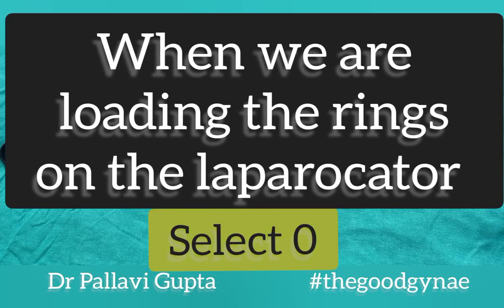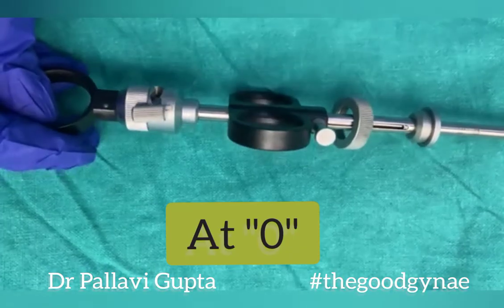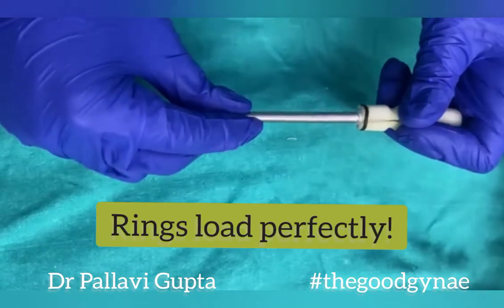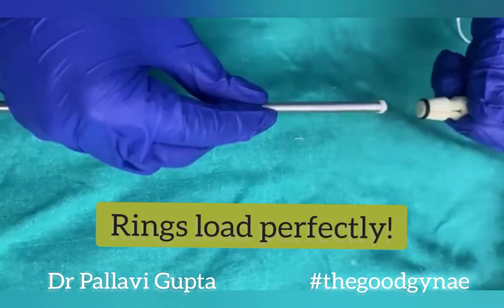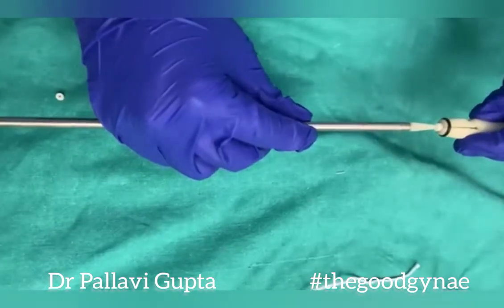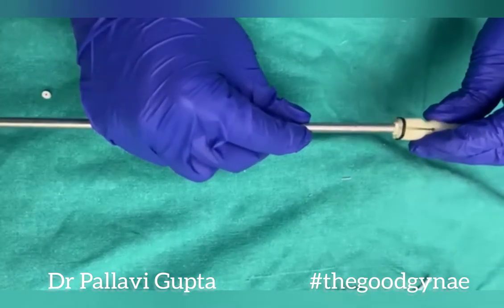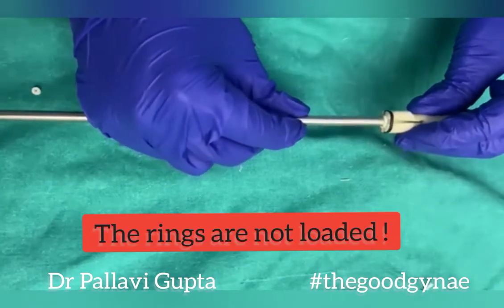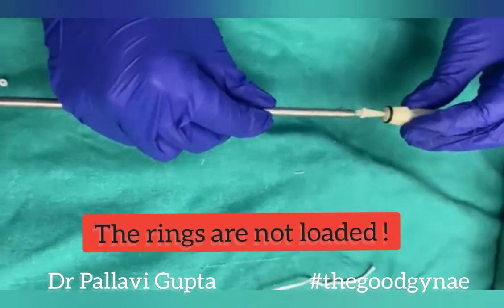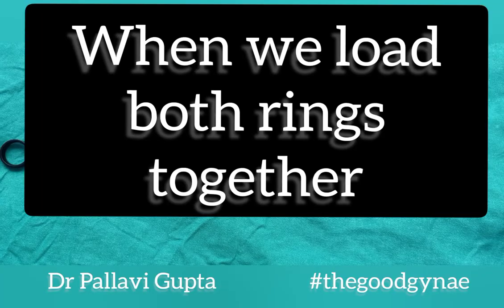When loading the rings on the laprocator, selecting 0 means the inner sheath doesn't move, and we are able to load the rings nicely. On the other hand, if we select 2, the inner sheath goes inside while we are loading the rings, and we will not be able to load the rings onto the inner sheath.